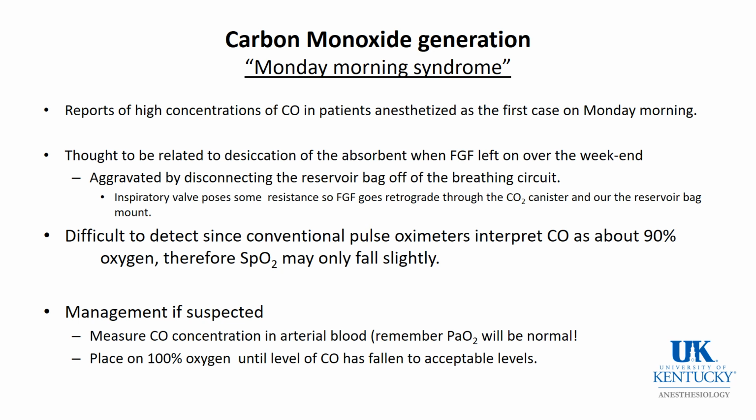These were patients found to have high levels of carbon monoxide when anesthetized as the first case on Monday morning. On analyzing it, it was thought to be due to desiccation of the absorbent when the fresh gas flow was left on over the weekend, which caused drying of the absorbent.